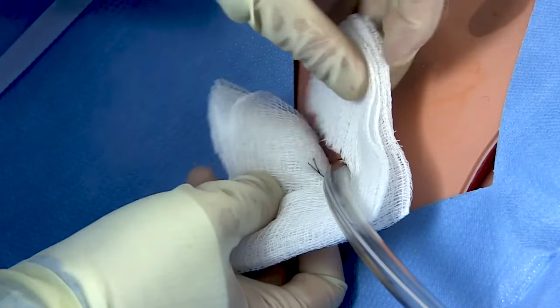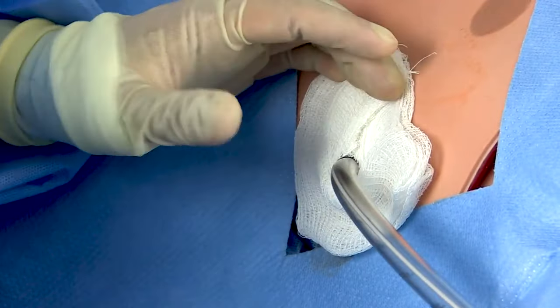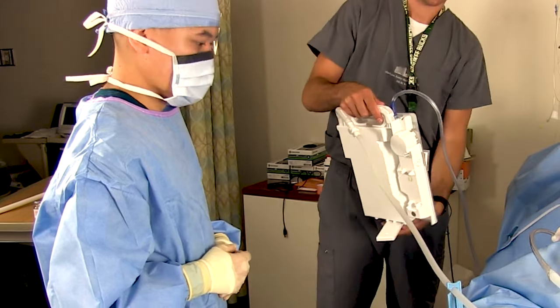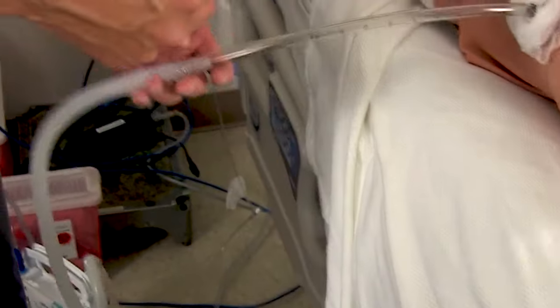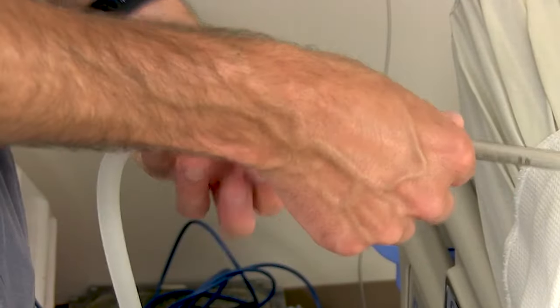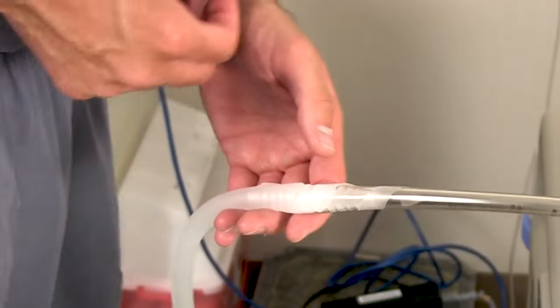Now you can dress the chest tube. Some people will put some Xeroform over it before applying a little gauze sponge. Cut a little slit in the gauze and put your tape of choice — a lot of people like foam tape for this. Hand the atrium to a bedside nurse or assistant who can help you hook it up to wall suction, clean up your sharps, and get the drapes off. Remember to reinforce the Christmas tree connections with some tape — use skinny strips spiraled around the connection rather than one thick wad of tape, so you can still see the actual connection if you need to troubleshoot it later.